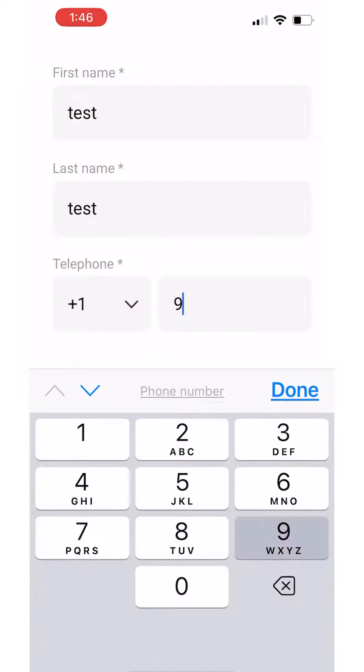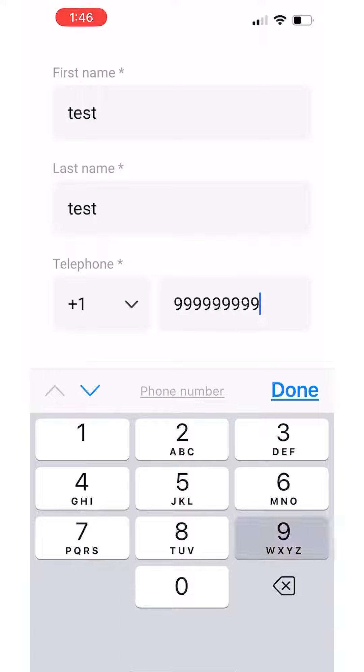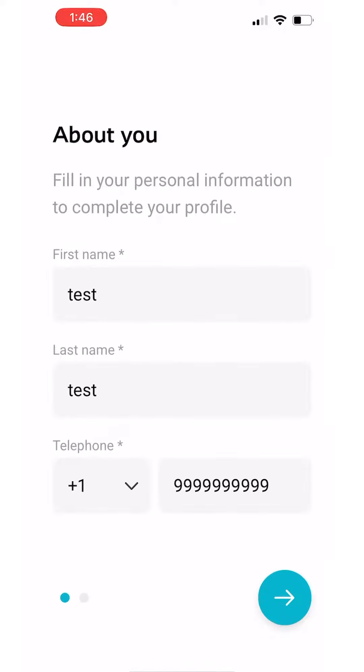Step 6. Fill in your first and last name and your phone number to complete your profile.